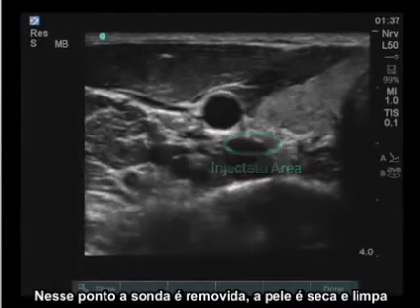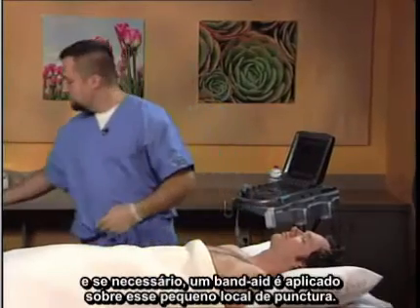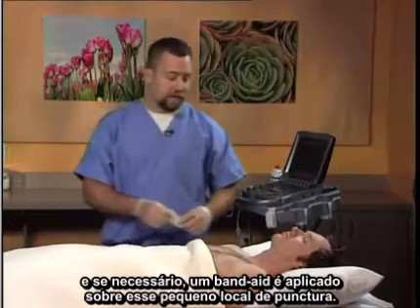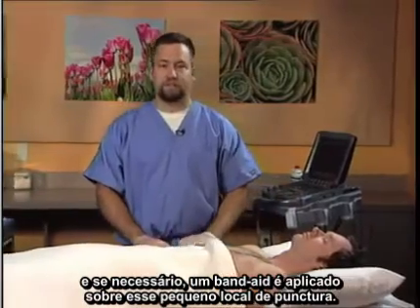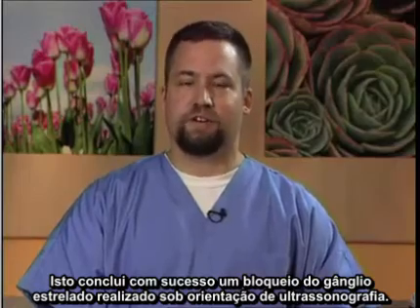At this point, the probe is removed, the skin wiped and cleaned, and if needed, a band-aid placed over the small puncture site. This successfully concludes a stellate ganglion block performed under ultrasound guidance.